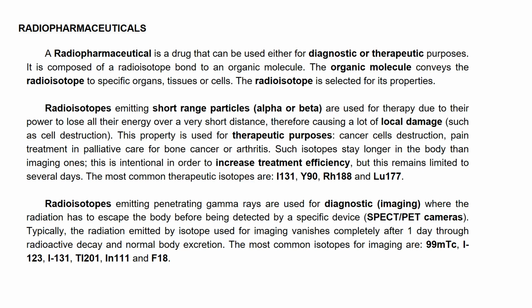Radiopharmaceuticals. A radiopharmaceutical is a drug that can be used either for diagnostic or therapeutic purposes. It's composed of a radioisotope bound to an organic molecule. The organic molecule conveys the radioisotope to specific organs, tissues, or cells. The radioisotope is selected for its properties.